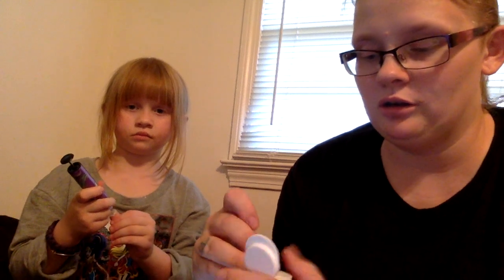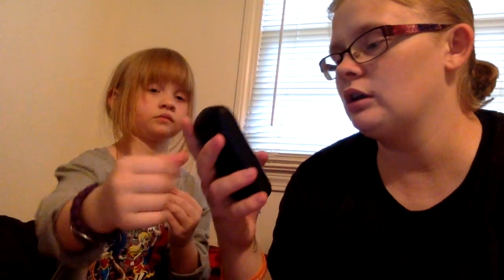I'm going to get her meter soap. You've got to do it twice, because it wants to be sure that the number's right. So if you prick it two times and they're like 100 points off, then you know something's wrong and you need to figure out what's going on. Ready. Okay. Hang on. It's got to come up.